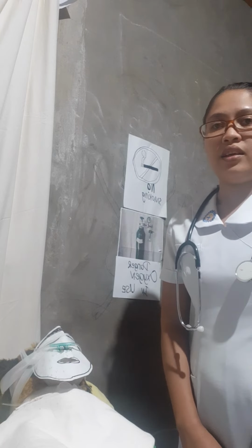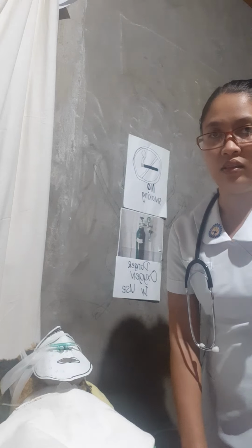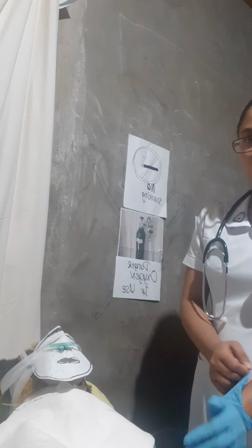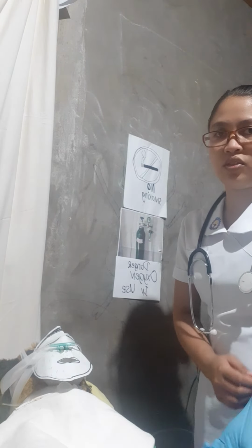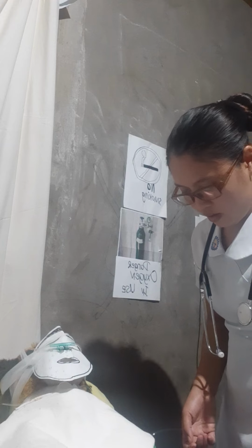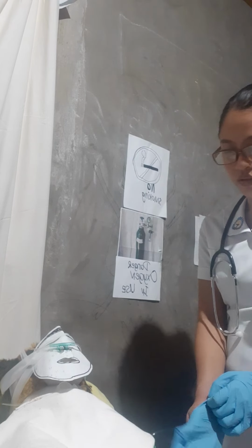And next, put on disposable gloves. We need to secure the end of the suction connecting tubing in a convenient location so that we are not going to have difficulties later on.